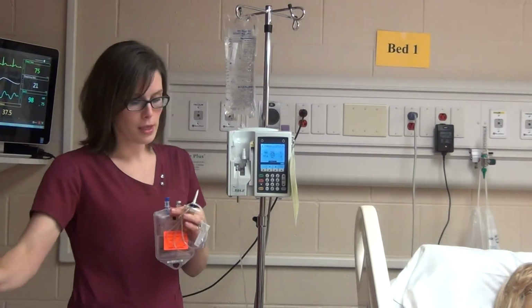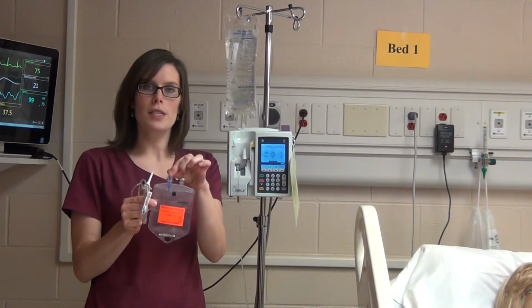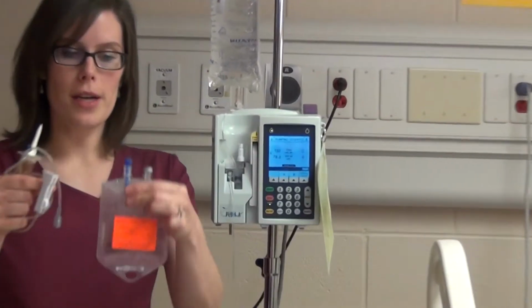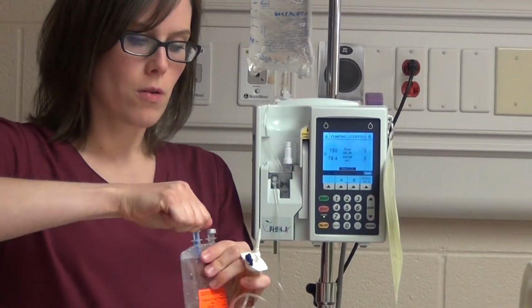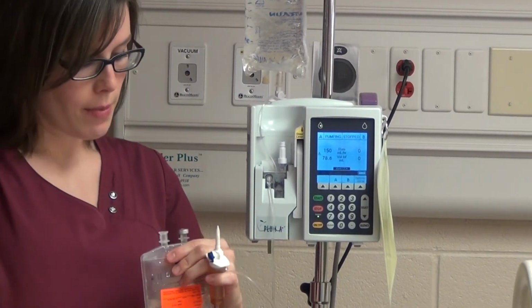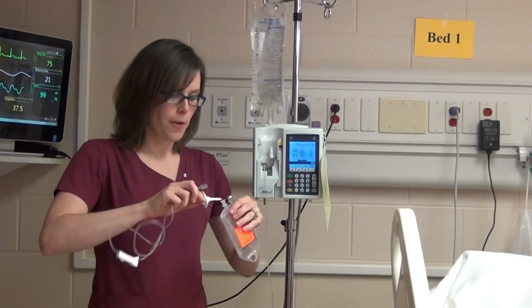So we have our hanger. I'll set that here. And the other thing in the lab that we do is we use golf tees because we reuse our IV bags. So pull this out when it's upright. Don't turn it this way and pull it out, or it's all going to spill. So you can just take this out. Always make sure that your clamp is closed. You can spike it.